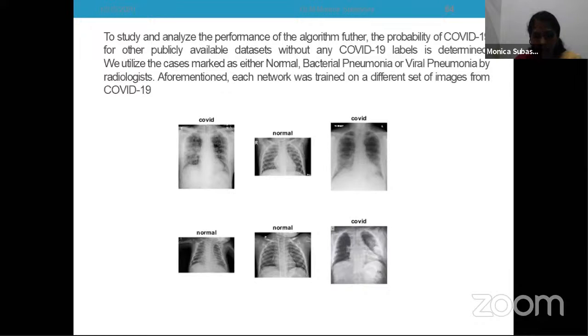Right now, people are suffering with respiratory disease. We cannot say that he is having COVID. No, we cannot say, because most of the symptoms overlap. So based on the X-ray images, it's necessary for us to differentiate a normal respiratory process from COVID. We need to differentiate or distinguish. This is one particular task.